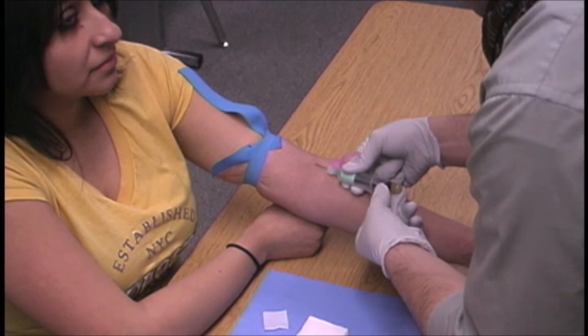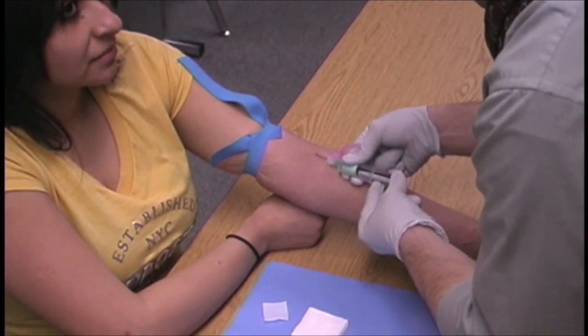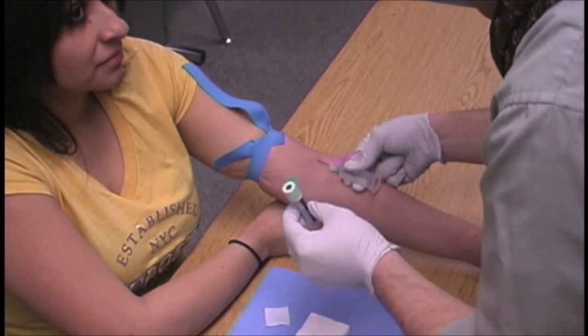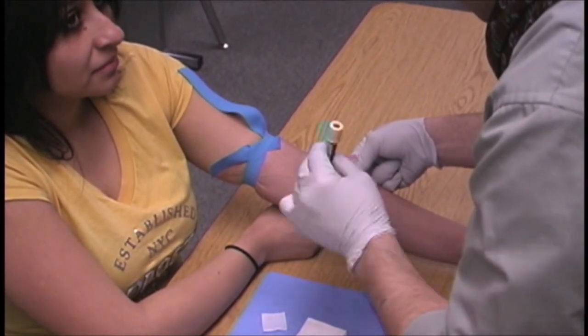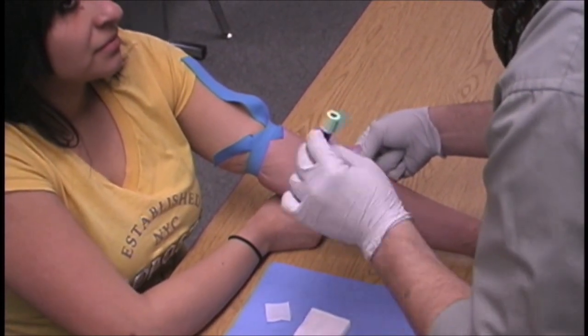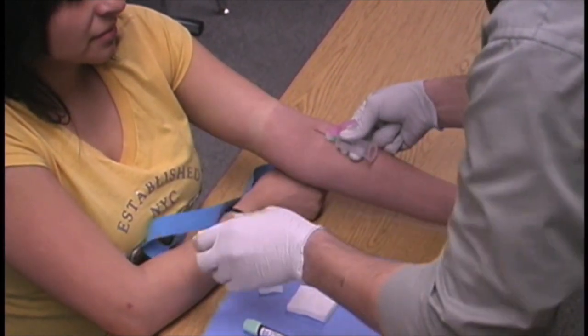He is now going to remove the tube, gripping it between his thumb and middle finger and lifting off with his index finger. He mixes the blood in the tube with the anticoagulants six to eight times, then puts the tube down and releases the tourniquet.